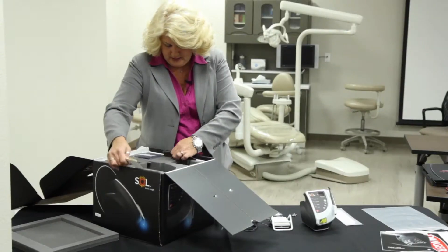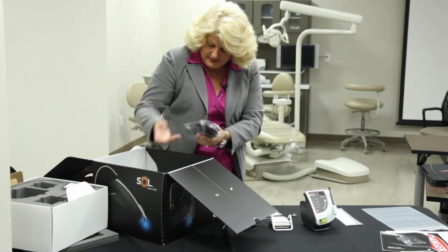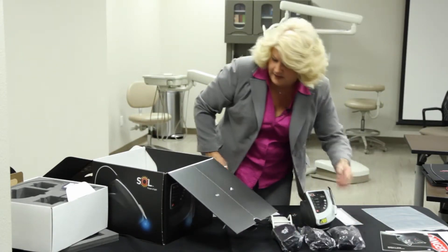And then underneath here you will find your safety glasses. The standard — that's three that come with all of Denmat's lasers: one for the doctor, one for the patient, and one for the assistant.